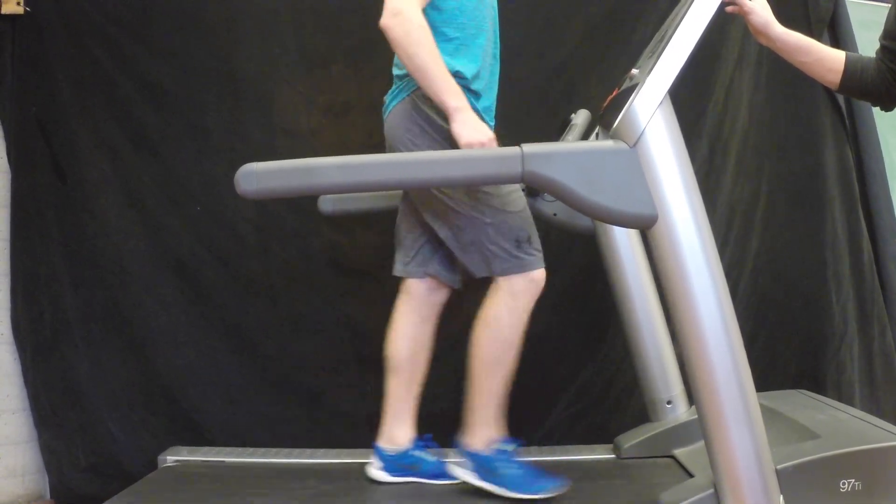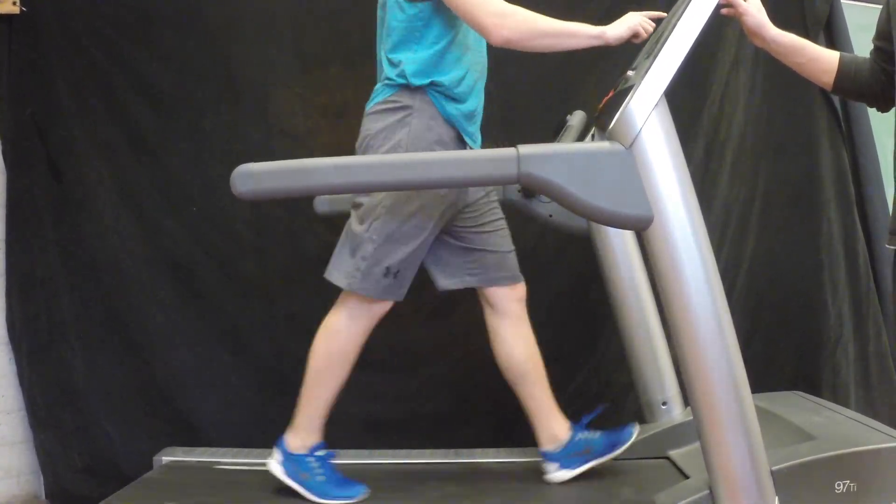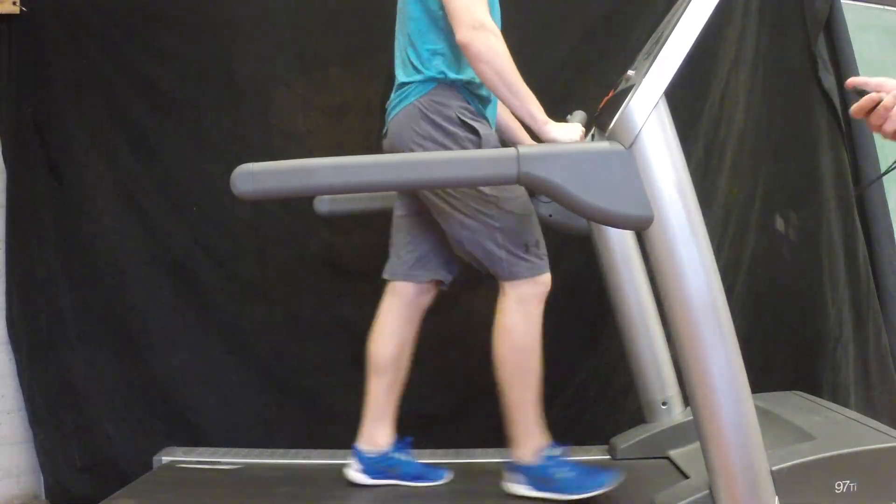This test is a good choice for the elderly because of its slow pace. You can also place a marker on the wall in front of them at eye level to help them with their balance.